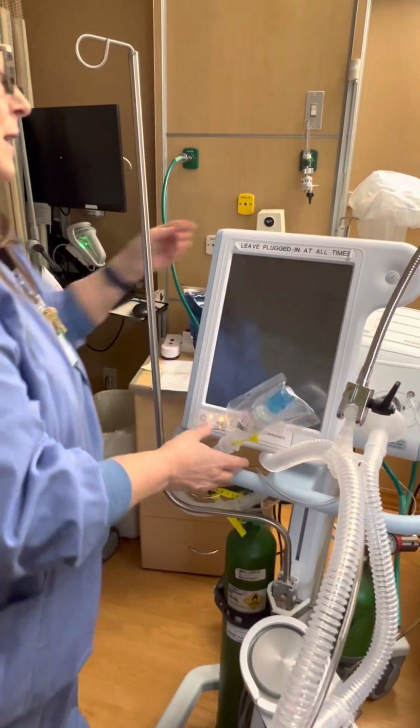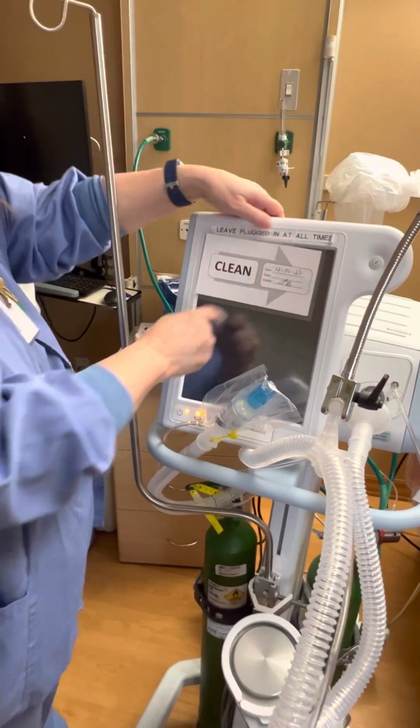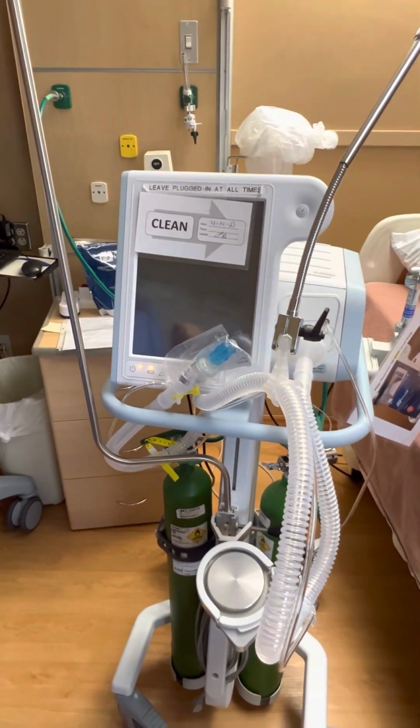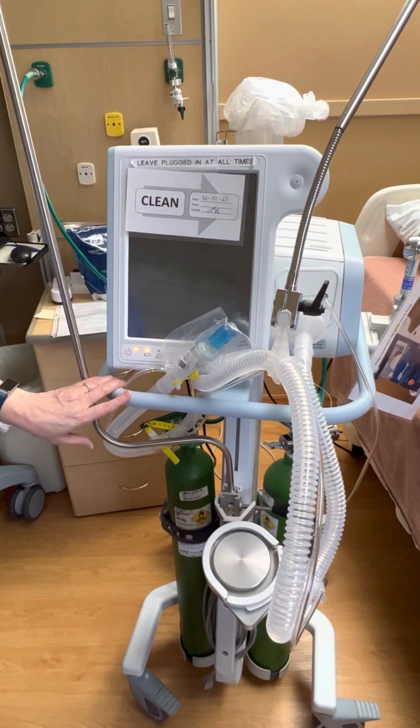And make sure you put your sign back on there saying the date and your initials, that it was clean. Push it back to where your floor keeps these, and then make sure that you plug it back into the wall so that battery always stays charged. You never know when you might need it for transport.